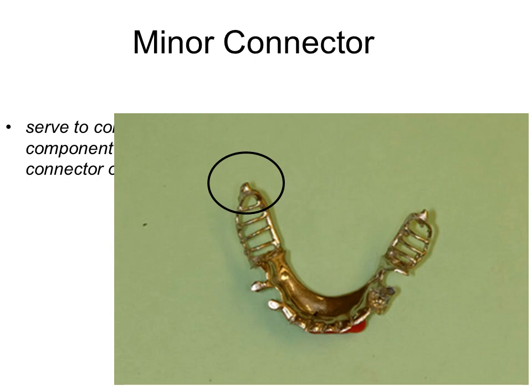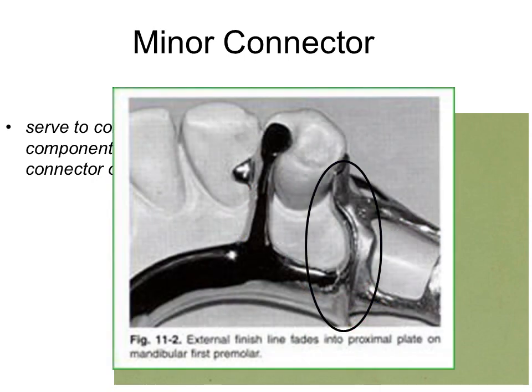The tissue stop is an integral component of denture base retentive elements. It provides stability to the framework during processing, and provides stability to the framework during record procedures. It should be present on all extension base RPDs. Finishing lines are found wherever acrylic joins the metal framework. Finishing lines are found on both internal and external surfaces of the denture, and are generally a 90-degree butt joint design.